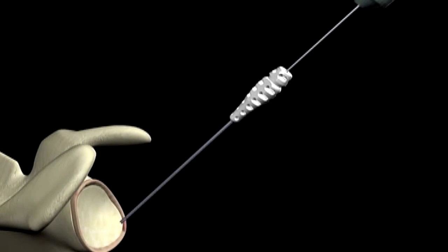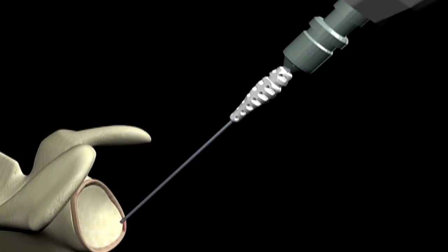Insert the juggernaut drill into the drill guide. Advance the drill until contact is made with the guide. Remove the drill.